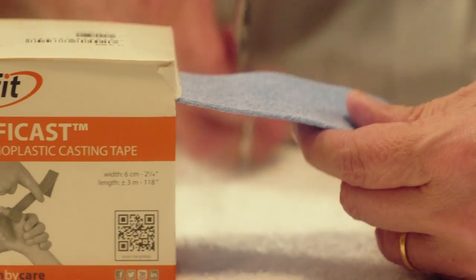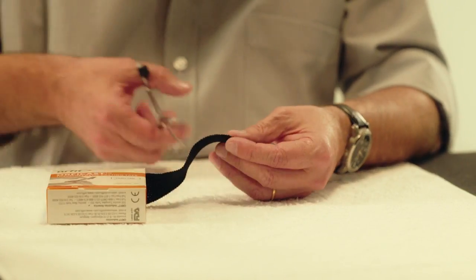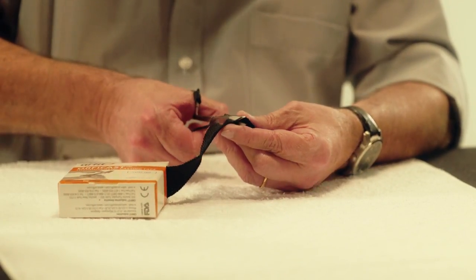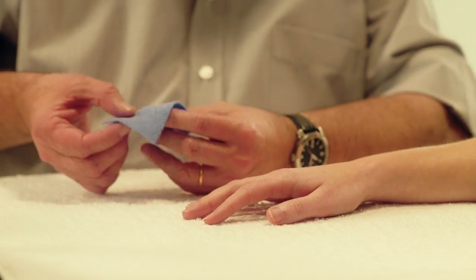Use a strip of Orficast 6 cm wide and 10 to 12 cm long, and a second strip of Orficast of 3 cm wide. Cut the 3 cm piece in two lengthwise.